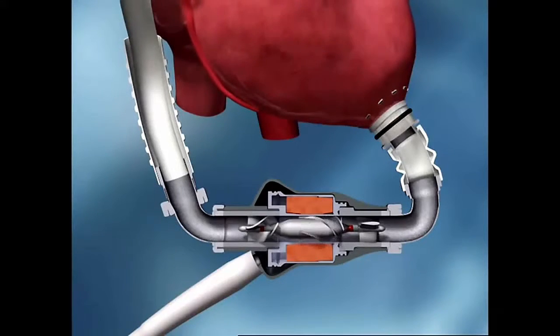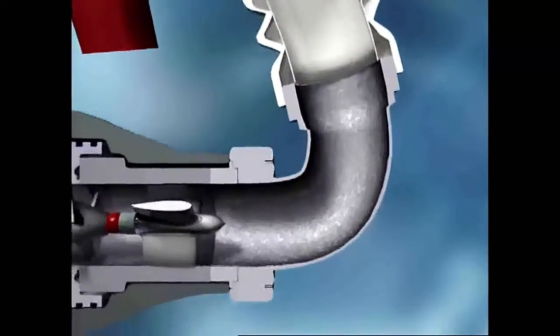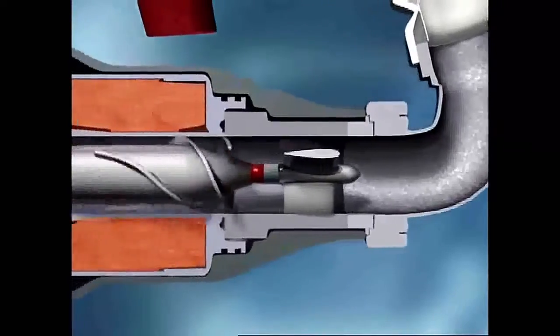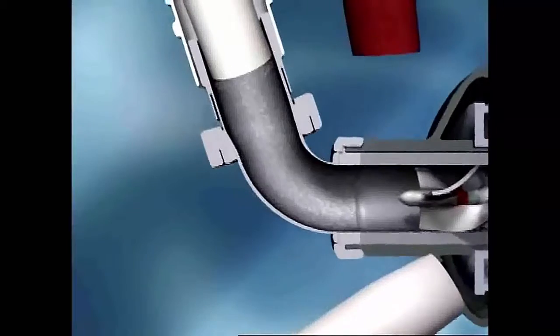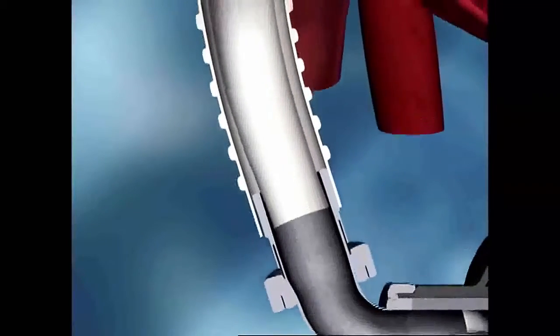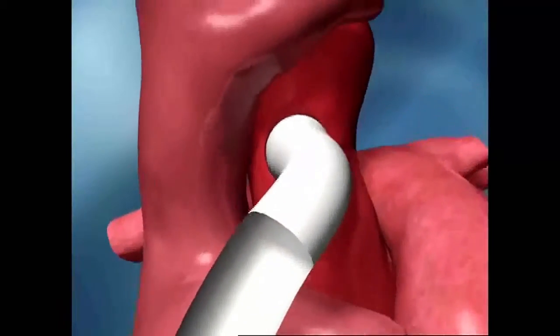The HeartMate II is implanted just below the heart. The flexible inflow cannula is attached to the apex of the left ventricle, and the outflow cannula is attached to the ascending aorta. The HeartMate II pumps blood from the weakened left ventricle to the aorta, the main artery feeding blood to the entire body.